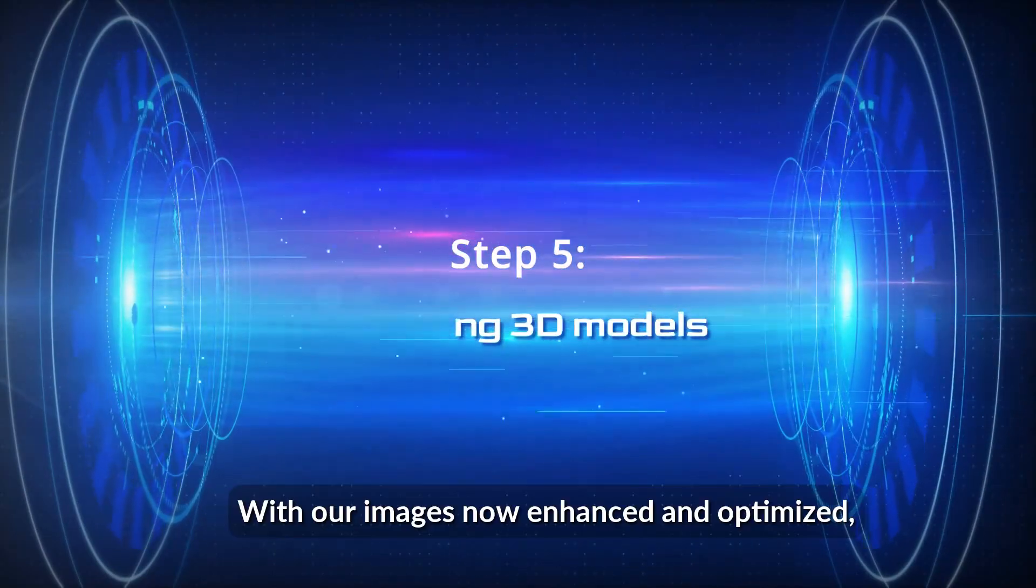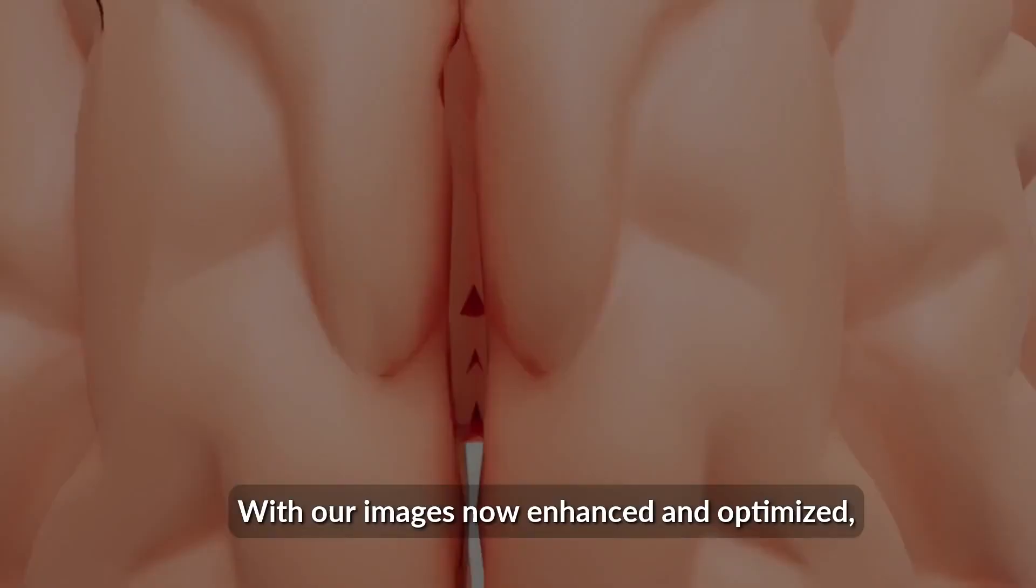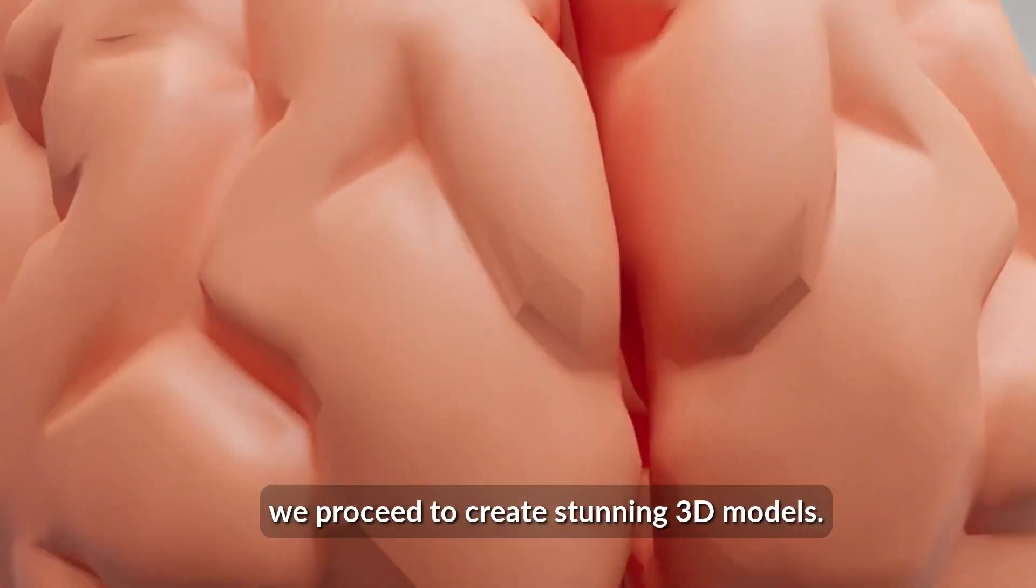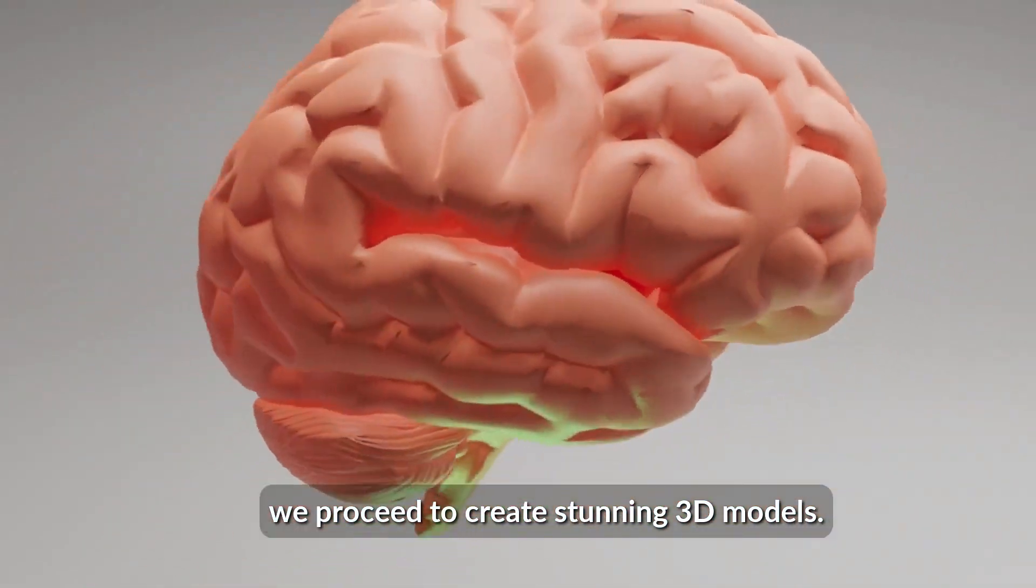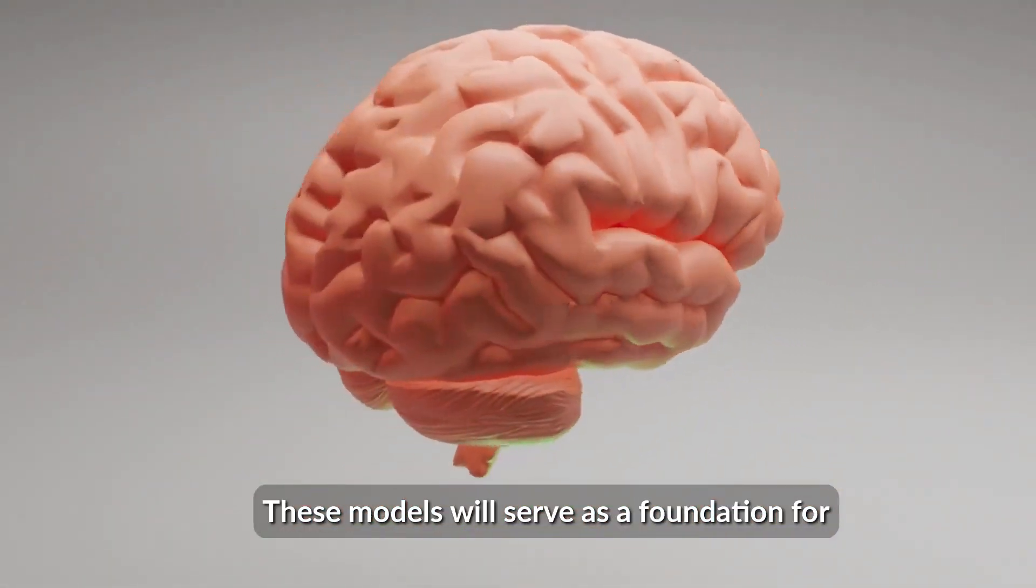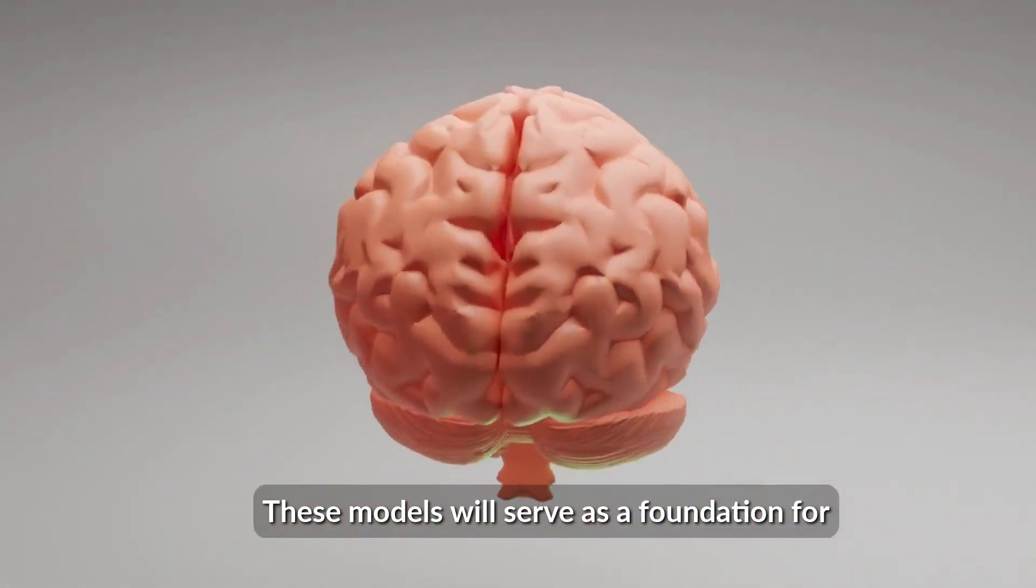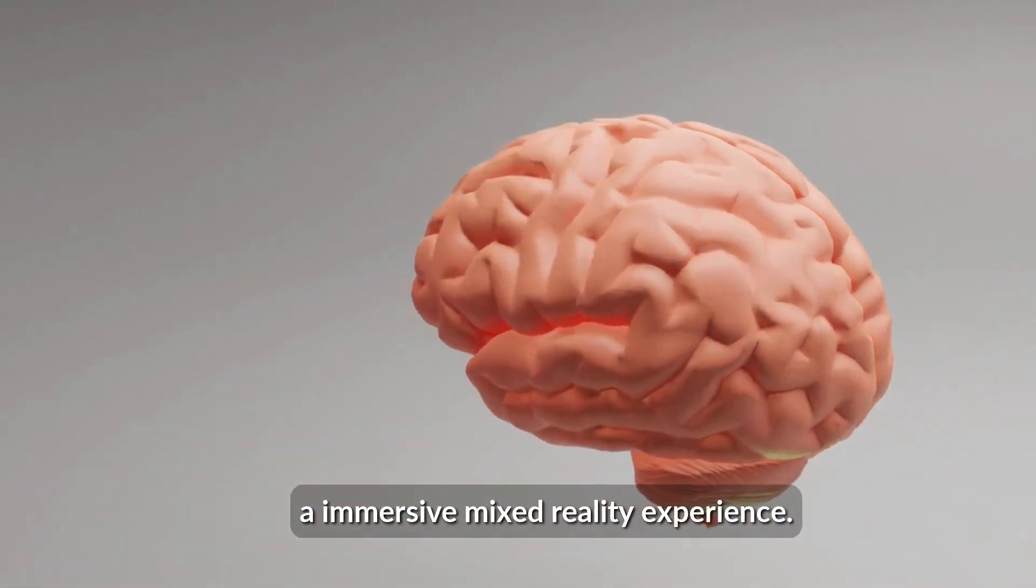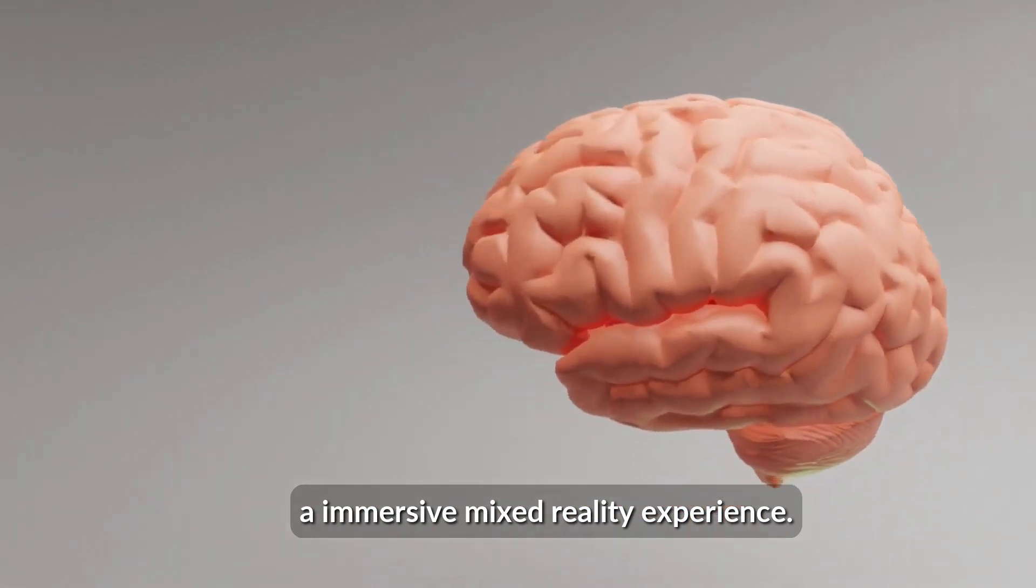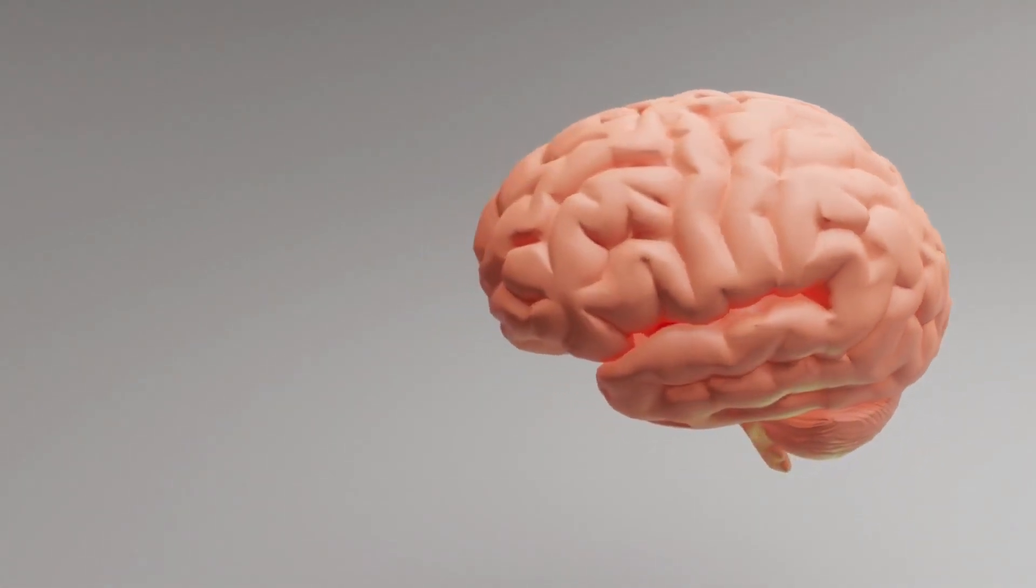With our images now enhanced and optimized, we proceed to create stunning 3D models. These models will serve as a foundation for our immersive mixed reality experience.